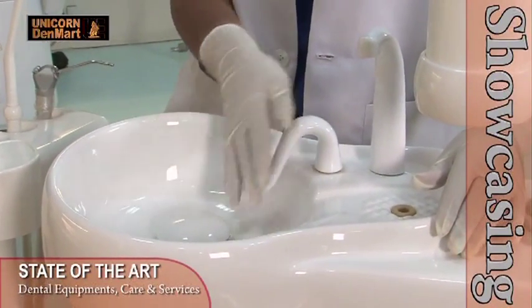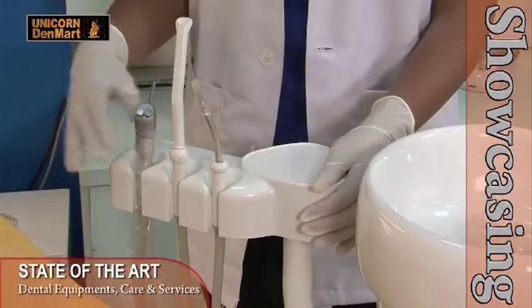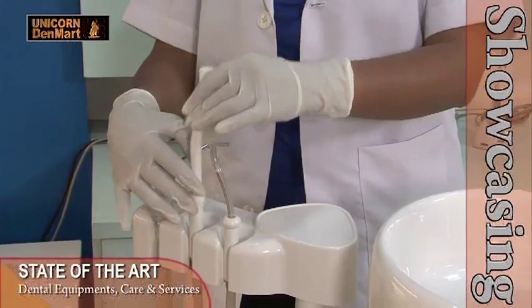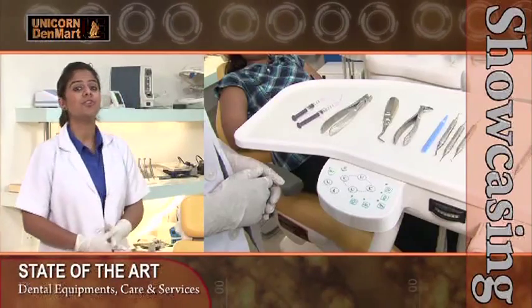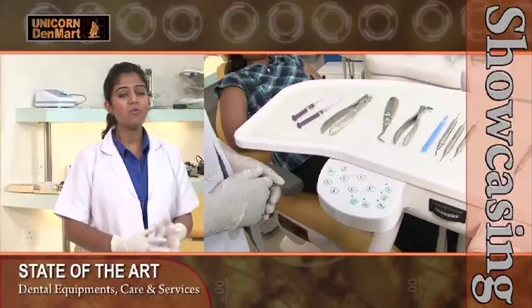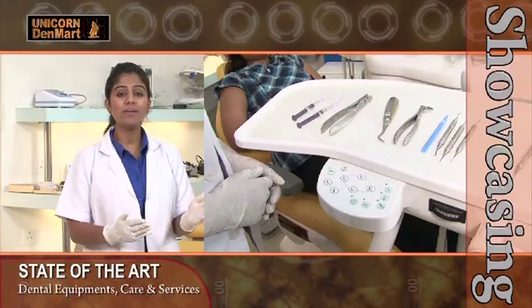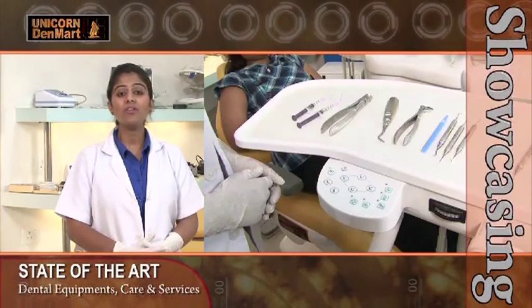The chair has an automatic cup filler with an option for both hot and cold water. It works effectively with a three-way syringe and two suction cannulas — for low vac suction and medium vac suction — mounted on the assistant arm. It has a traditional delivery unit with a pneumatic locking arm to prevent displacement of the delivery unit while performing treatment on the patients. It also has a wide instrument tray for easy access to the dental instruments while treating your patients.